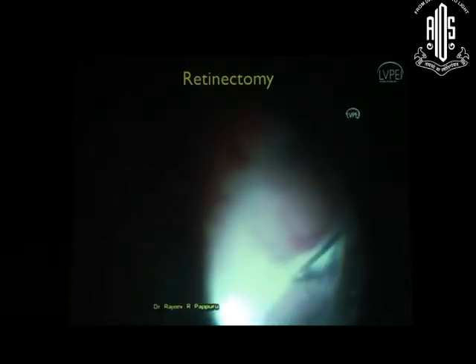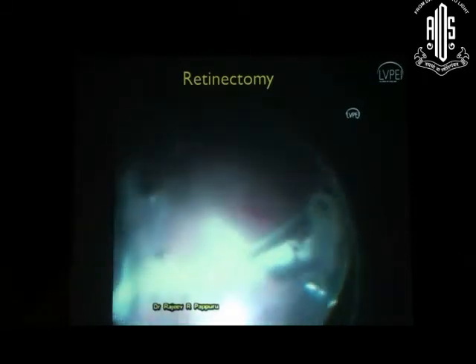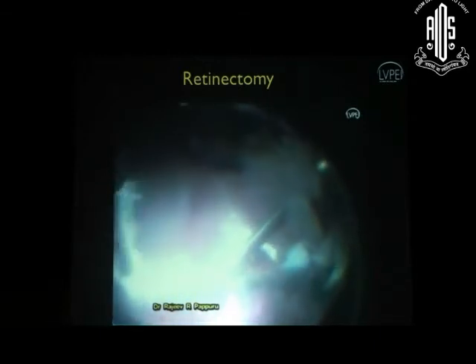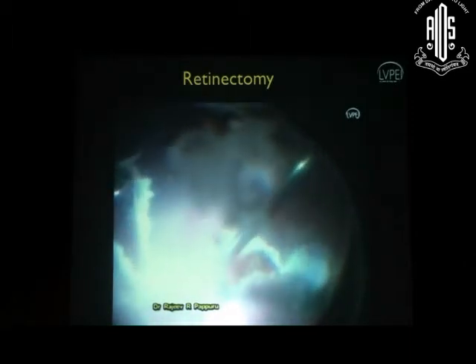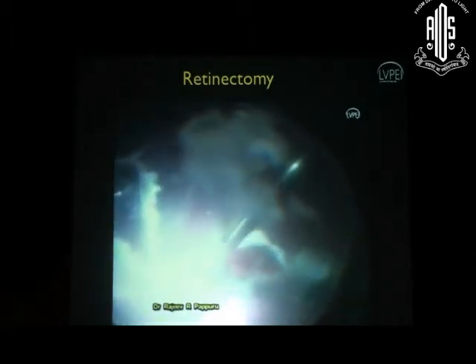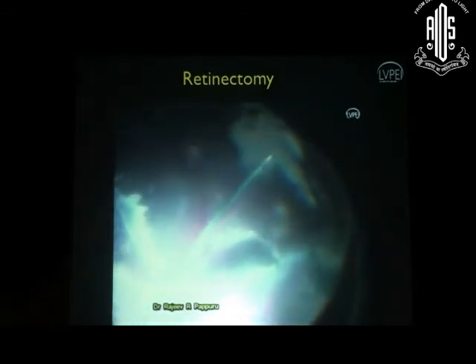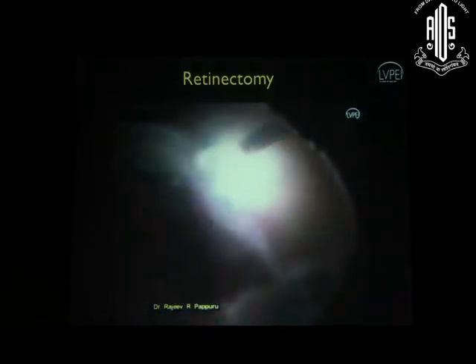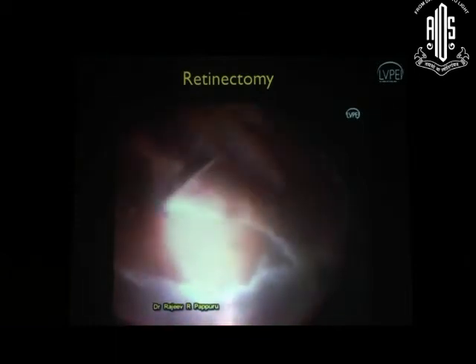So I had to cut the retina there to flatten that fold, to look for any subretinal membranes in that area. Fortunately there were no subretinal membranes there. So I had to cut the retina and then put it back. I usually use a cutter to cut the retina. You can even use vertical scissors if you have, but nowadays with the cutters I don't think we need to use scissors any more. The cutters are as good as scissors right now, especially the vertical scissors.